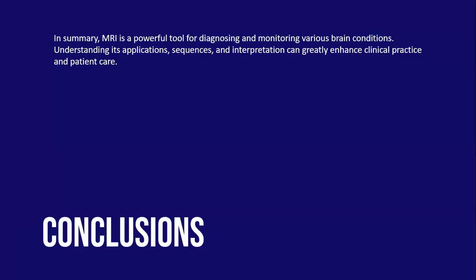We have discussed how to read an MRI in an OSCE station as an example. You go through the various steps and try to come up with a pathology. And then we've gone through some different pathologies you would see and how they would appear. And finally, what pitfalls you can avoid.